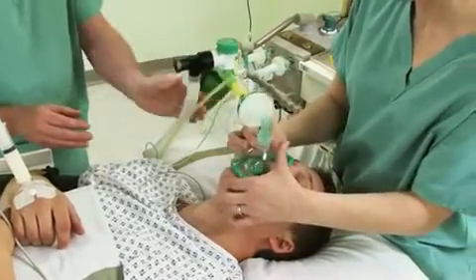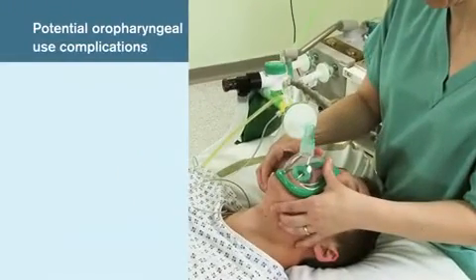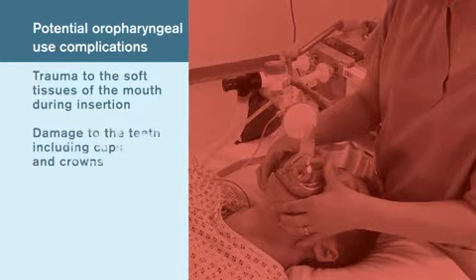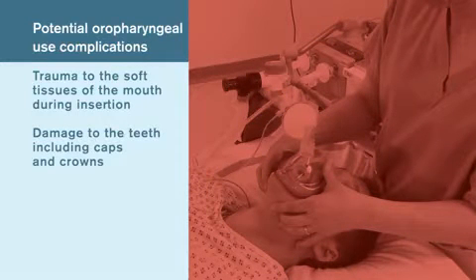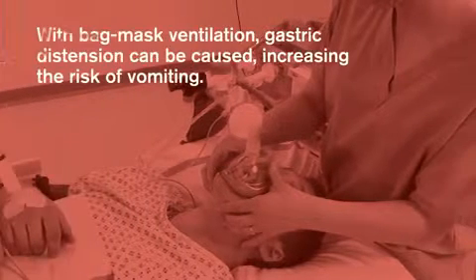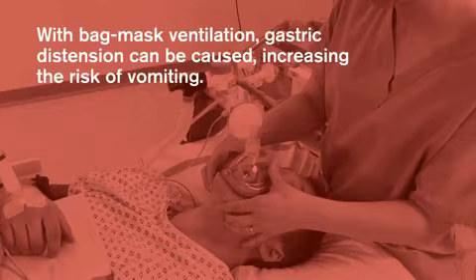Potential complications with the use of oropharyngeal airways include trauma to the soft tissues of the mouth during insertion, damage to the teeth including caps and crowns, vomiting, gagging, and laryngeal spasm. With bag mask ventilation, gastric distension can be caused, increasing the risk of vomiting.